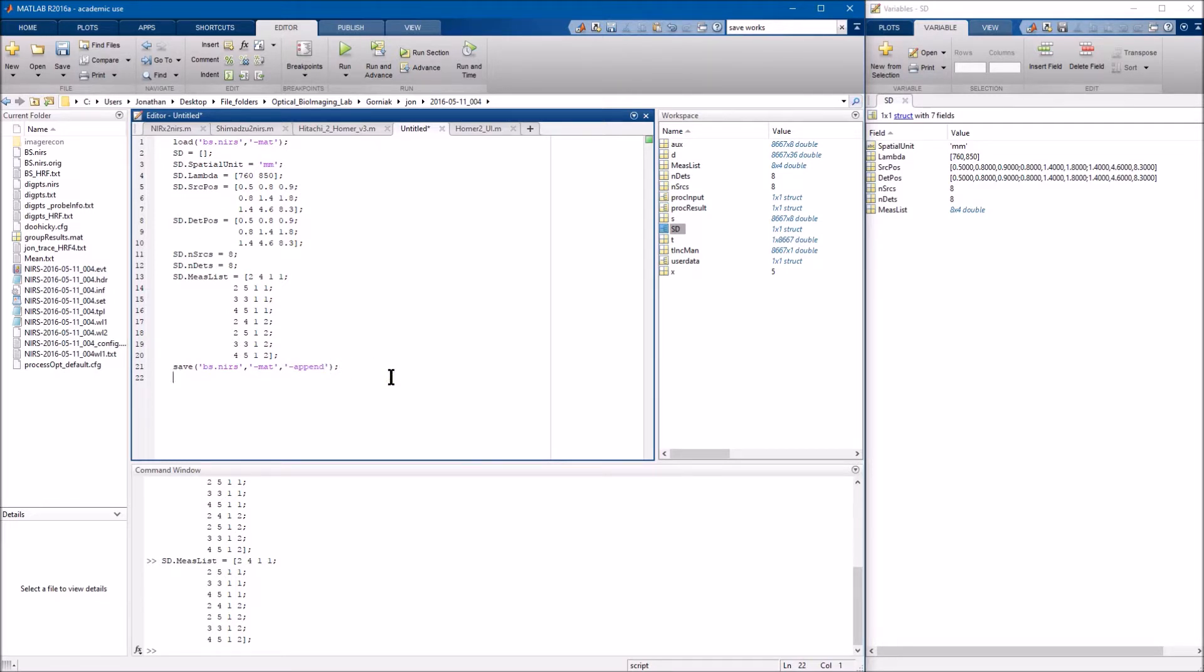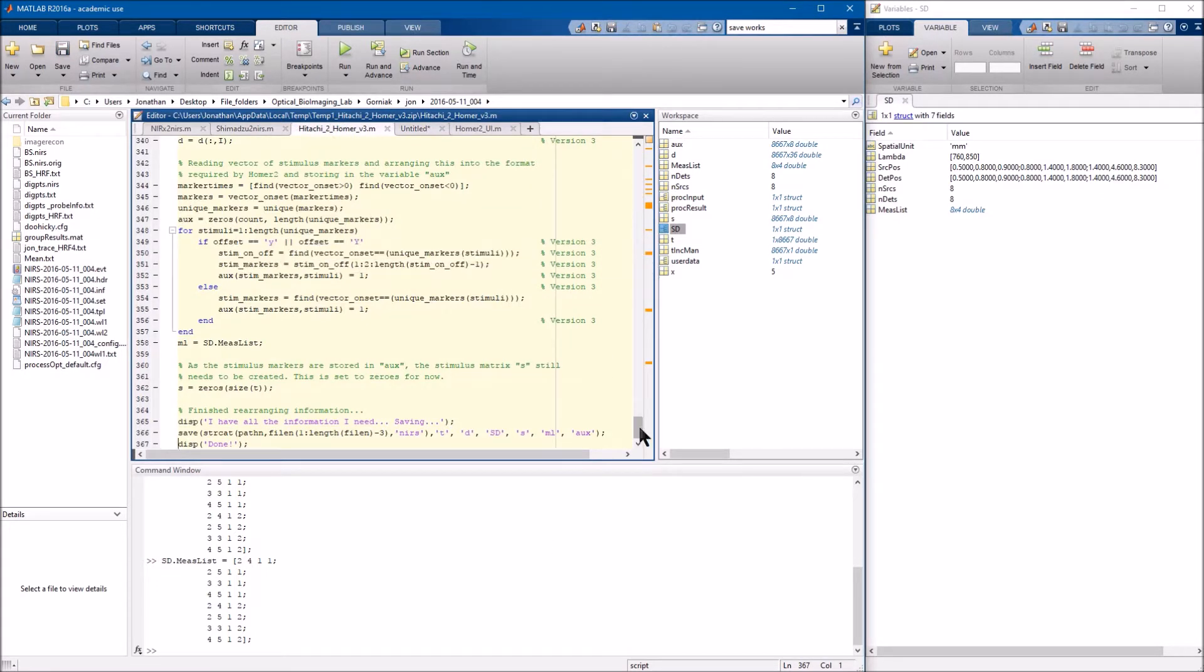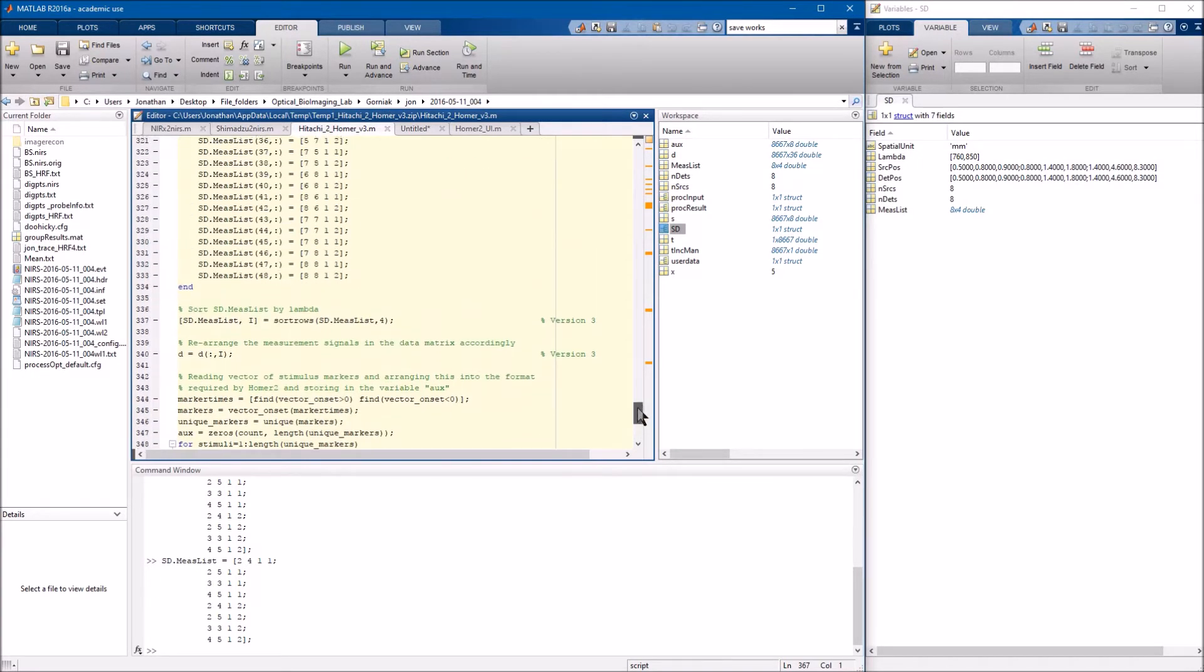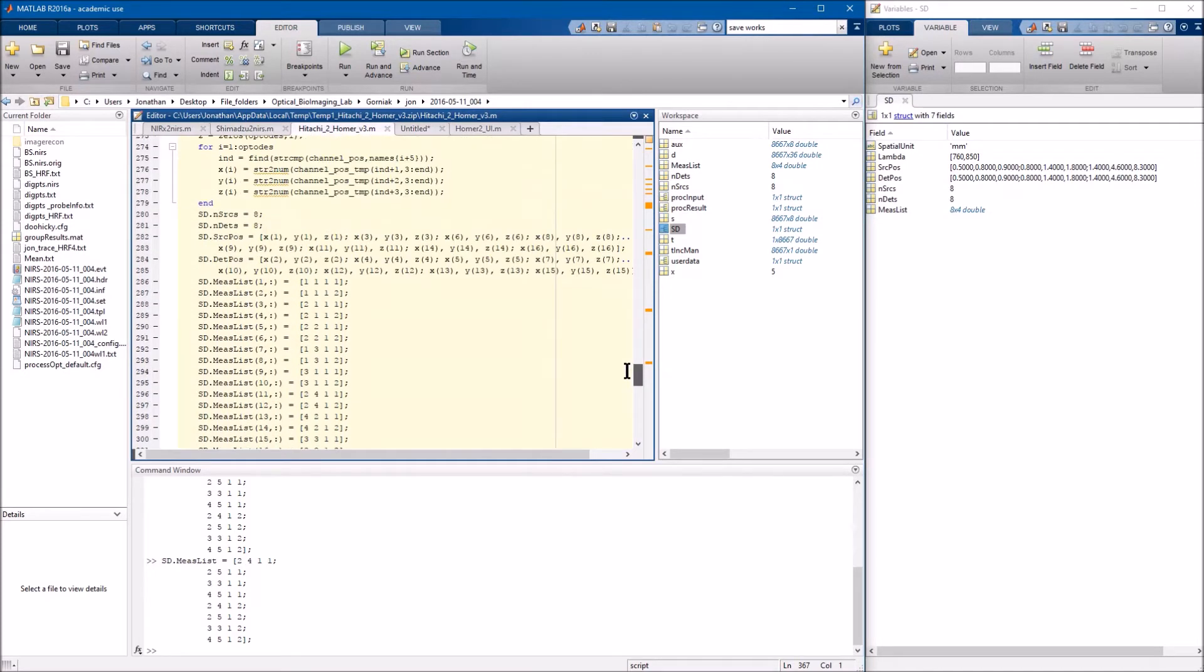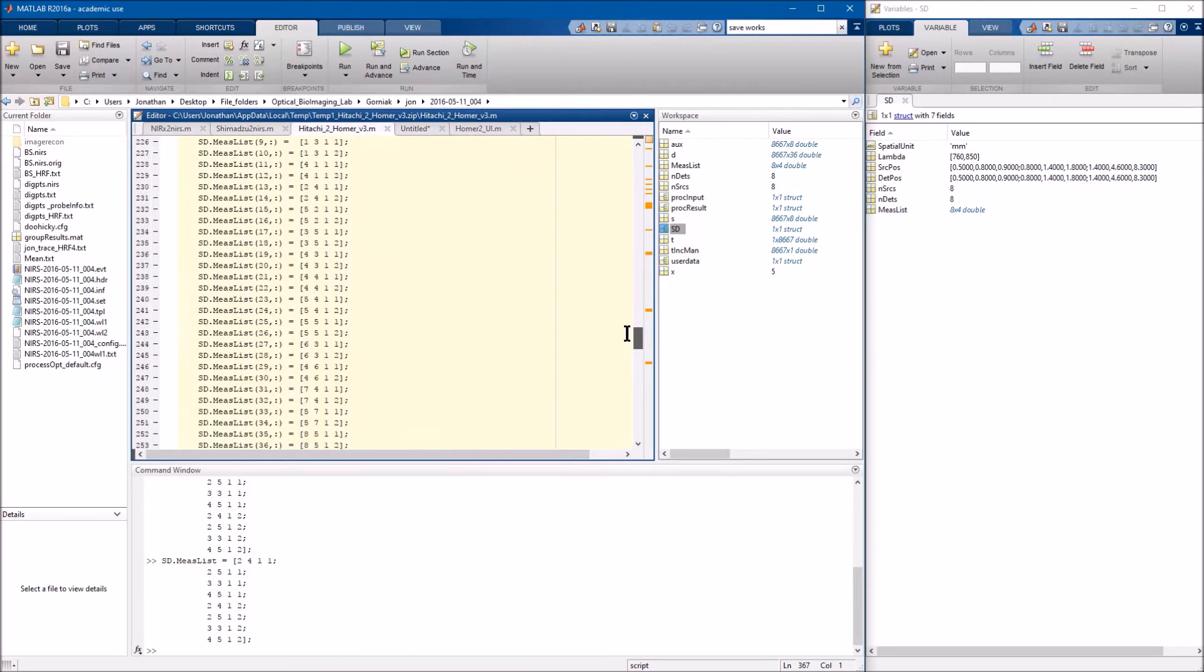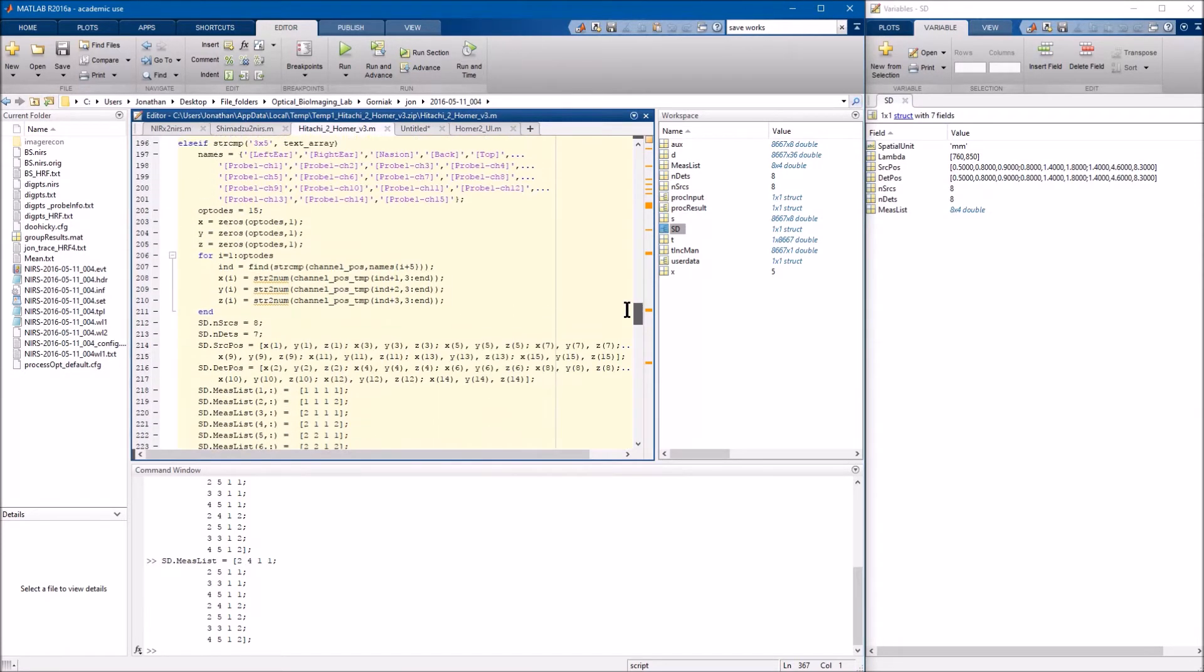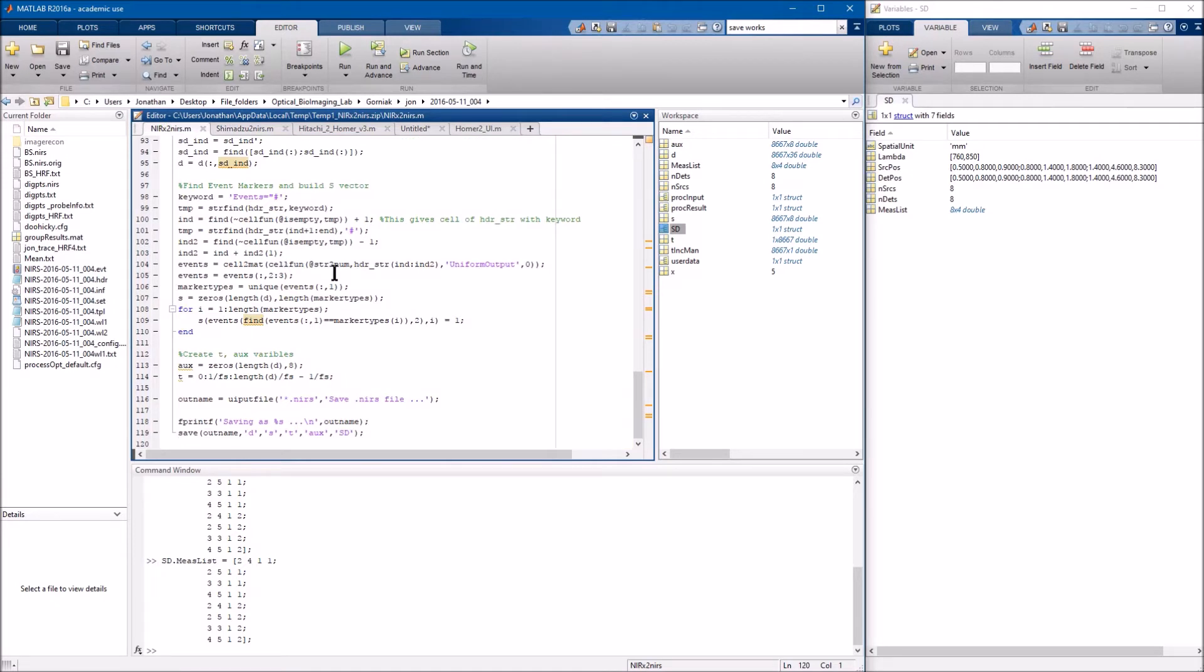Anyway, this is basically the gist of the SD file, how to create one. To review, the Hitachi to Homer does have everything except spatial units, so you'll see SD dot MeasList. It has a few others in here as well. You can see there's the total MeasList, which is quite a bit of code. Then you also have number sources, number detectors, the source and detector position, etc. Shimadzu is lacking that, and so is the nirex file as well.